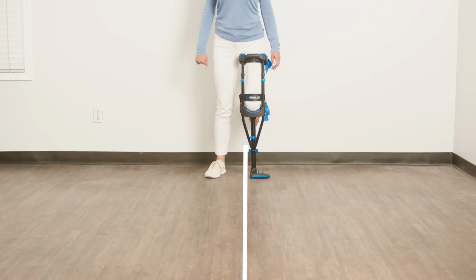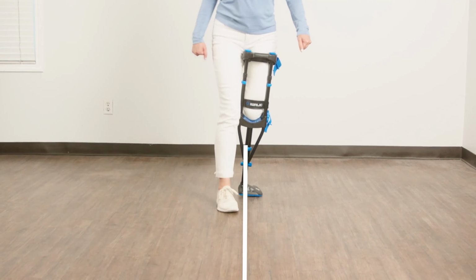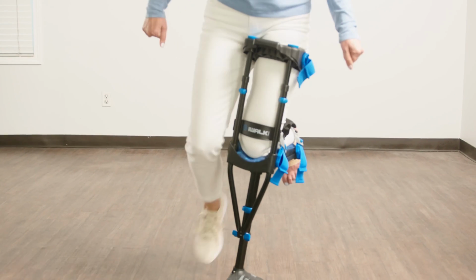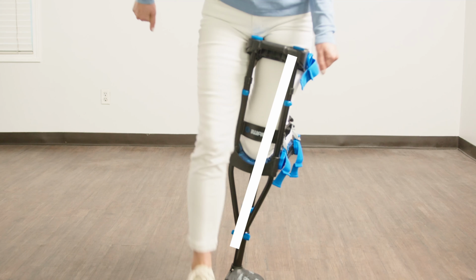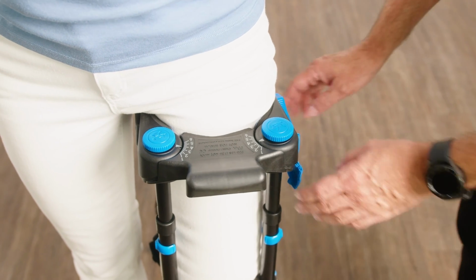The catwalk. Most people walk with their feet on either side of an imaginary center line. Some people walk with their feet on the center line or even over center line, much like a runway model walks. This results in the crutch angling inward and the patient walking on the outer edge of the foot. The solution is the same as for valgus correction.